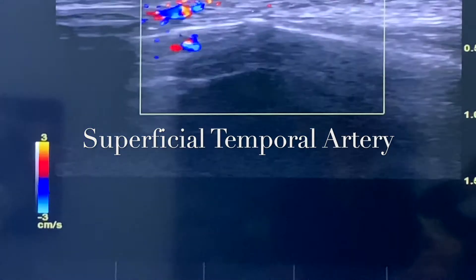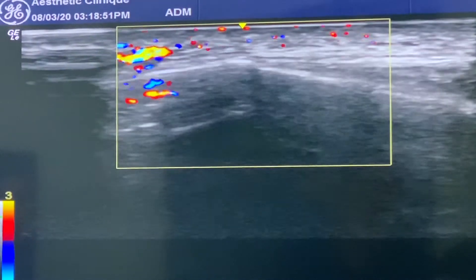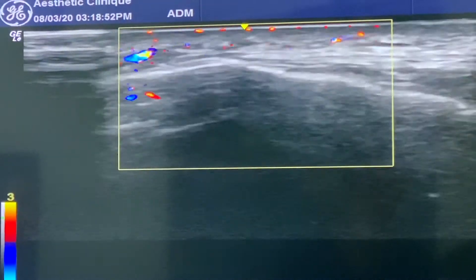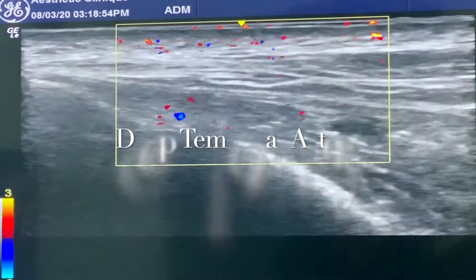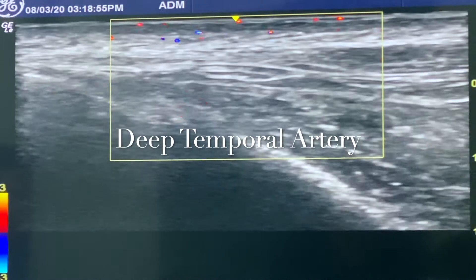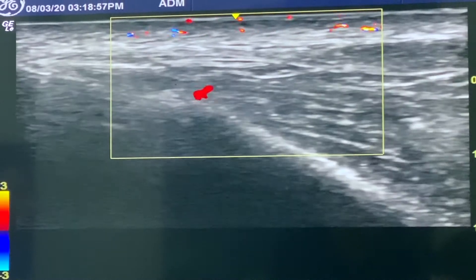What I'm looking at right now is the superficial temporal artery. And now there's a deep temporal artery, and we just saw that right there.